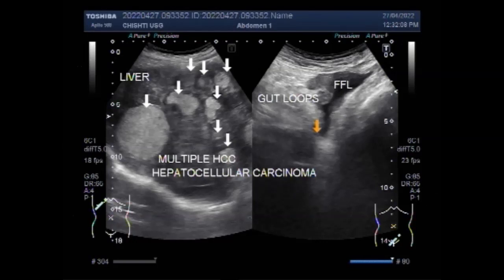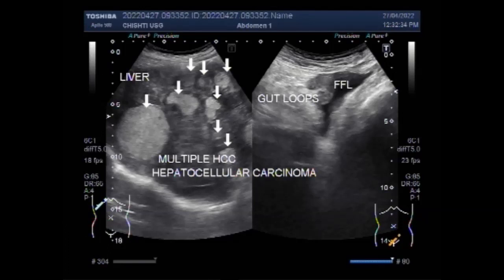Cancer staging includes a single tumor larger than 2 cm that has grown into blood vessels, or more than one tumor — none larger than 5 cm across — that has not spread to nearby lymph nodes or distant sites. Advanced staging involves more than one tumor with at least one tumor larger than 5 cm across. In this case, there are many masses that exceed these measurements.